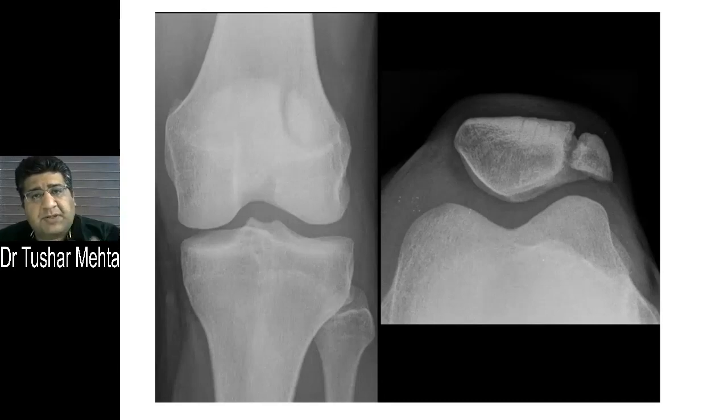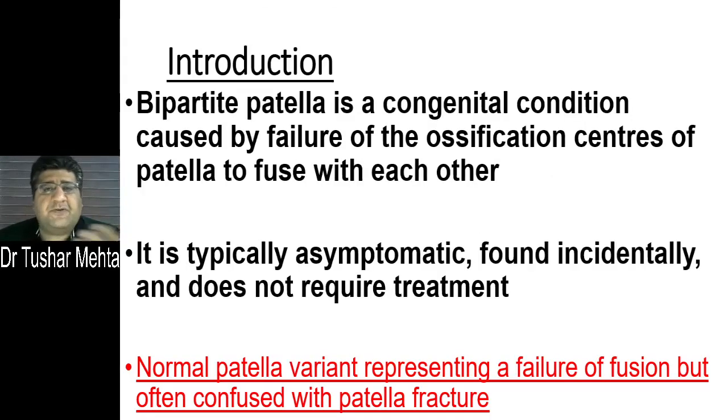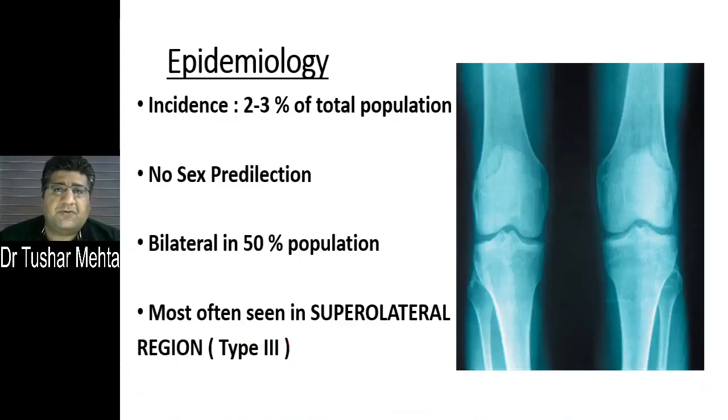But there are two problems. One, as a student, it's an important radiology spotter. The second important problem is that it is often confused with patella fractures. Don't worry, we will talk about that. First, let's talk about the epidemiology.